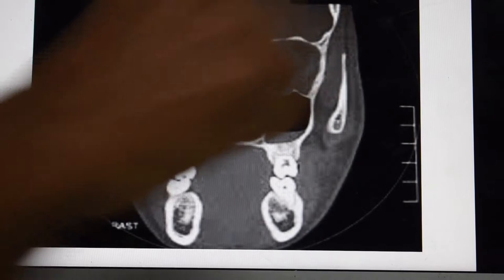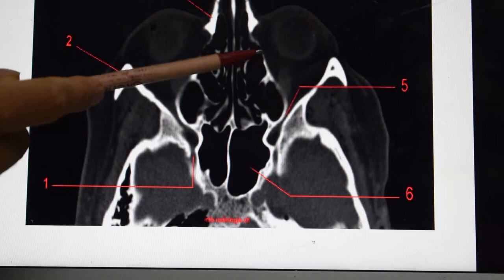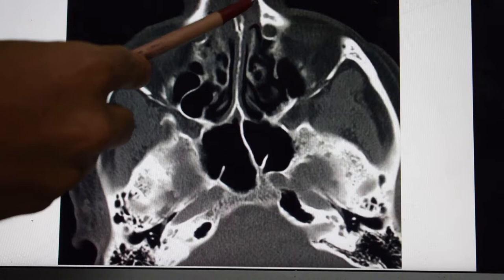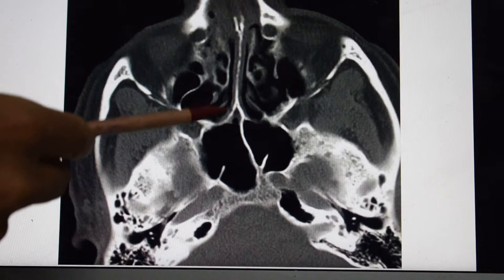Now this is the nasal bone — the most commonly involved structure in facial fractures. This shows the continuity of the nasal bone, but if a patient has a fracture, this continuity will be disturbed. You can see multiple fractures here — this is known as a comminuted fracture of the nasal bone. This is the nasal septum, which is in the midline and not displaced.